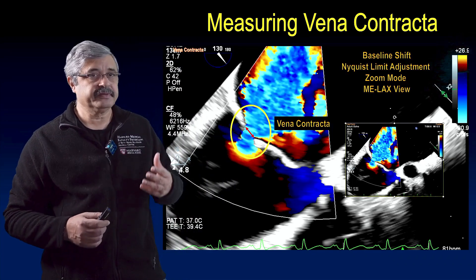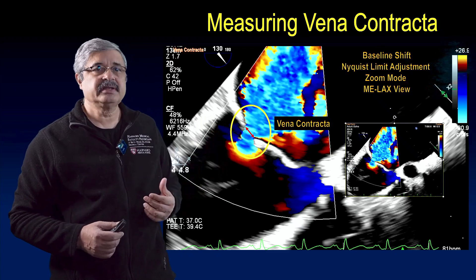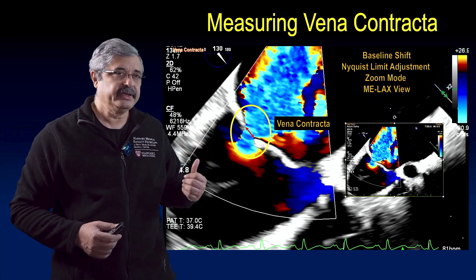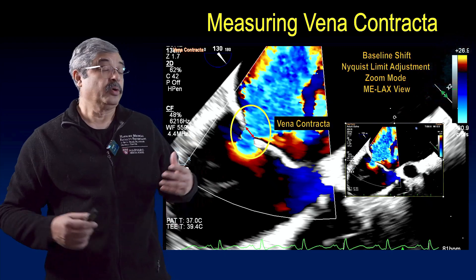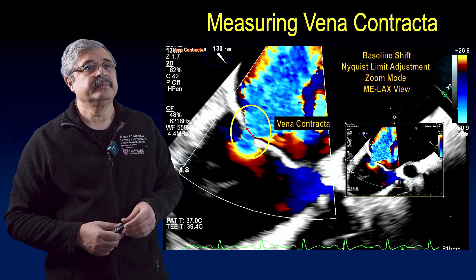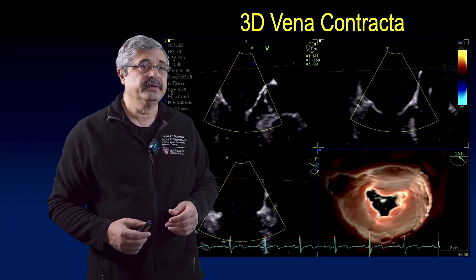To summarize my approach: shift the baseline towards the direction of flow when measuring MR — that is towards the left atrium — perform an adequate Nyquist limit adjustment, use zoom mode or reduce depth, and use the mid-esophageal long axis view to measure the vena contracta.